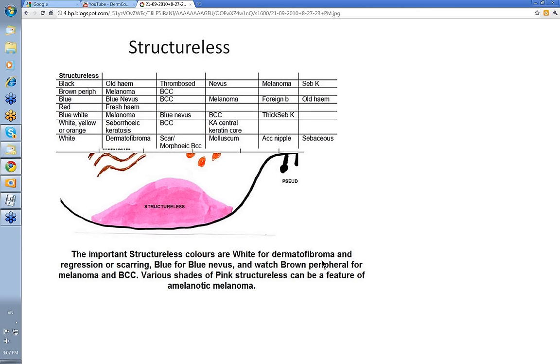The important Structureless colors are white for dermatofibroma — they're easy to see — and also you get a bit of regression and scarring. Blue for a blue nevus because it's so uniform normally. Watch brown peripheral for melanoma and BCC. And then various shades of pink Structureless can be a feature of amelanotic melanoma.